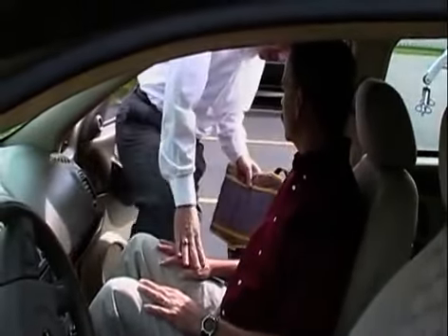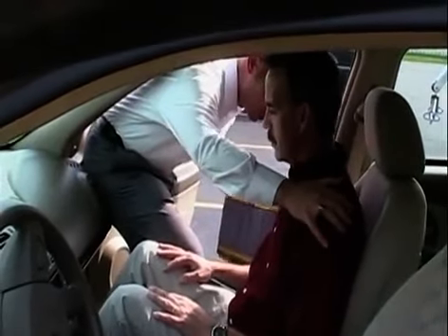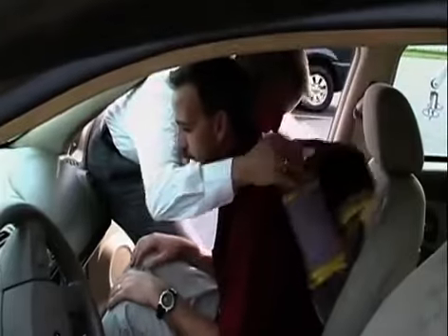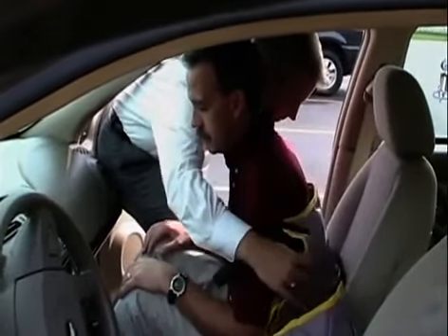The first thing I'm going to do is I'm actually going to fit a sling, and I'm going to use that to transfer you. If you can help me out, I'm going to lean you forward and I'm going to tuck the sling behind you, and actually put one of the legs and straps on each side.